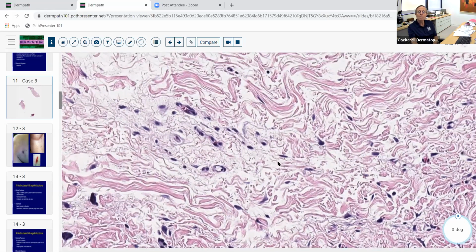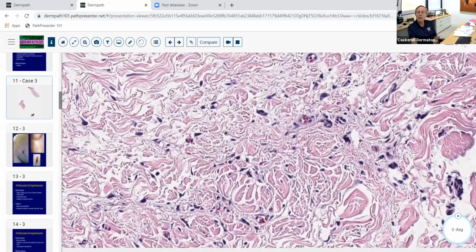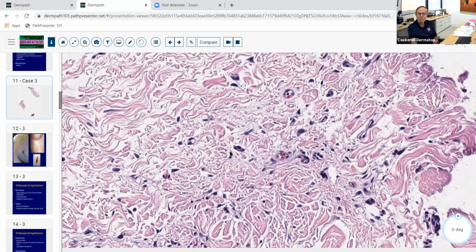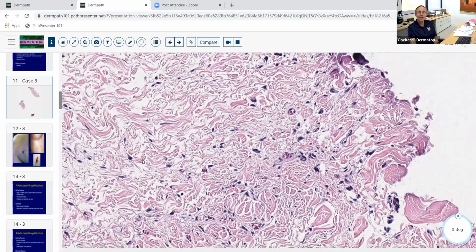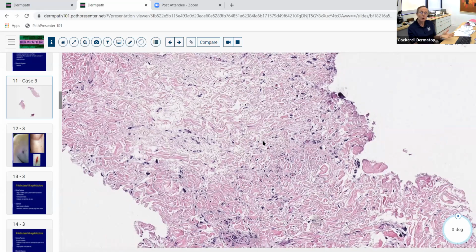So some neoplasms were named by people that were logical. They said, well, let's give it a name that makes sense. And so there's multinucleate cells. We're not sure exactly what cells they are, but maybe they're fibroblasts, maybe they're histiocytes. There are blood vessels, so we call it angio. They're cells, sure, they're cells. And then they look like histiocytes in a way. It kind of looks a little bit like a so-called histiocytoma, another name for which is dermatofibroma. So the name for this is multinucleate cell angiohistiocytoma.